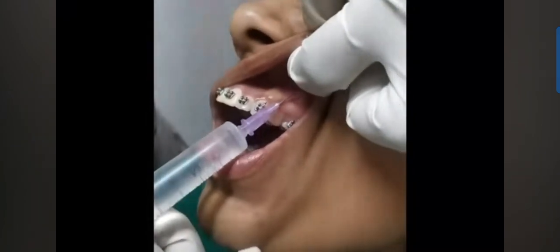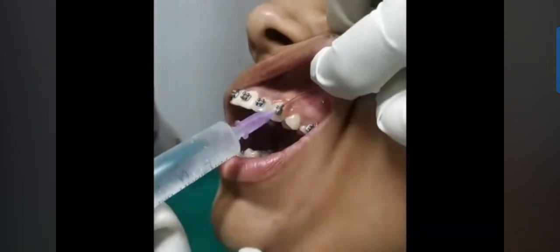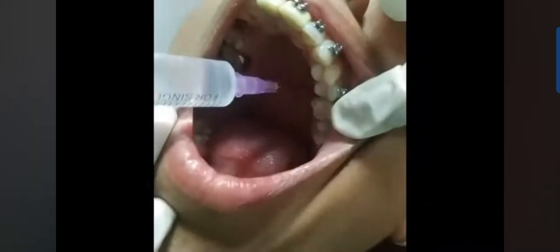Infiltrate the maxillary premolar region. So you can see that I have infiltrated the region near the maxillary premolar in the vestibular region. I haven't given any block because it is only a single tooth, and then I start infiltrating in the maxillary palatal region. Also, we infiltrate in the mandibular premolar region in the buccal and the lingual side.